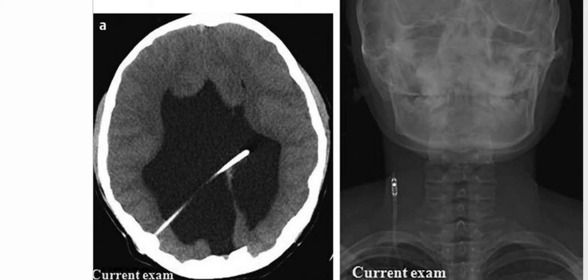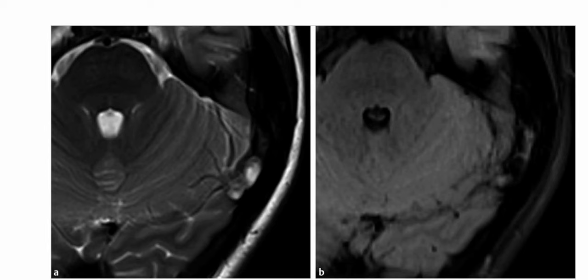Because of the shunt catheter malfunction. These are images of a 19-year-old woman who has presented with headaches, and on the axial T2 weighted MRI, there is a well-circumscribed ovoid hyperintense lesion within the distal left transverse sinus at the venous entry site. The majority of the lesion follows CSF signal intensity on the FLAIR sequence as well, with signal loss.